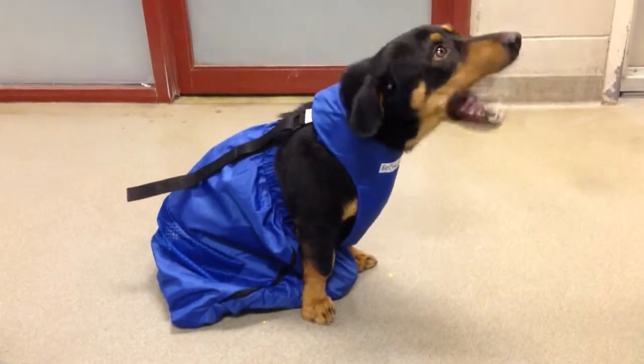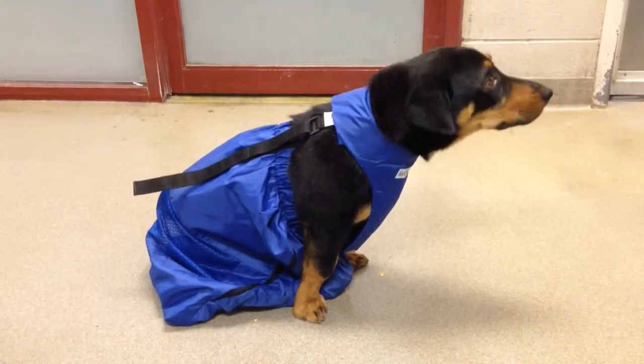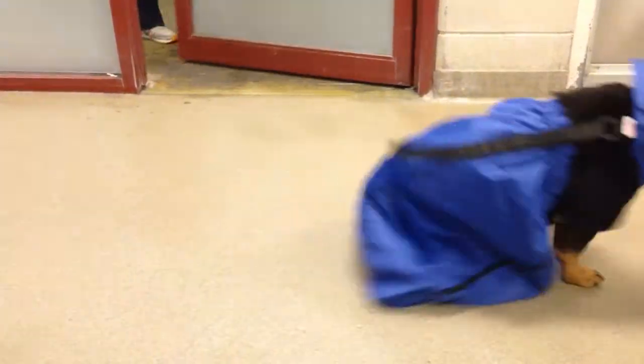Good boy, Ozo. Good boy. You're walking in? Whoa, come on — give it to me. Here we go, good boy.